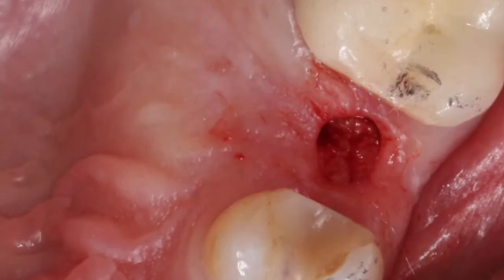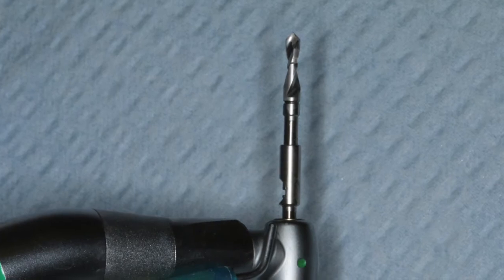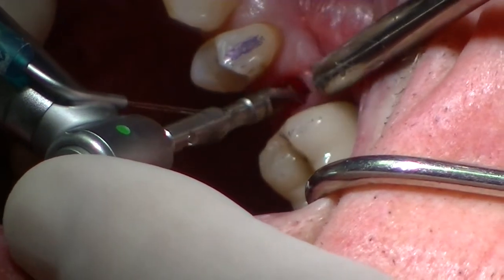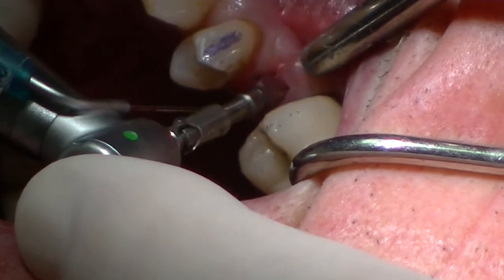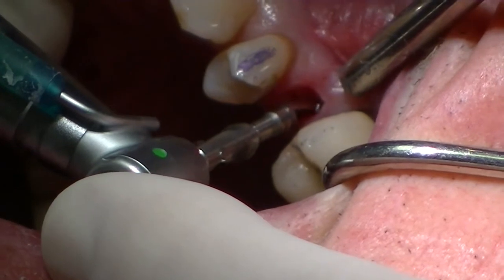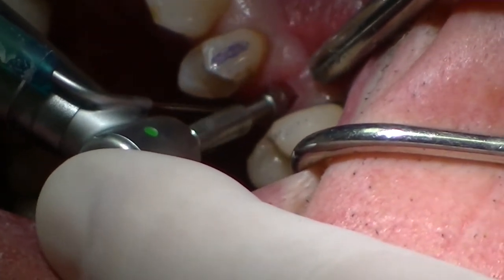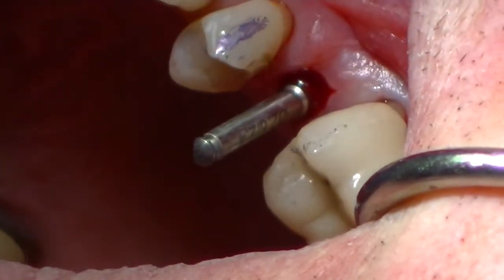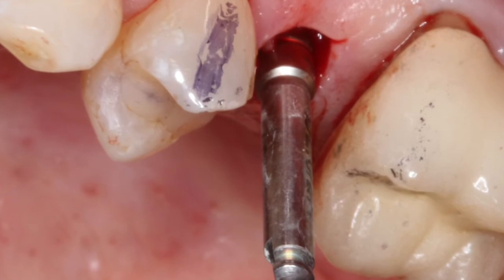Now I'm going to widen the osteotomy with our 3.0 diameter burr. These are preset at 8, 10, 11½, 13, and 16 millimeters. I can measure the soft tissue and determine the depth that I want to go into the bone. Angulation has been predetermined by the 2.4 diameter burr. To check it again, I'll reset that burr in the mouth and take a radiograph mesial-distally and buccal-lingually — we look like we're in good position.